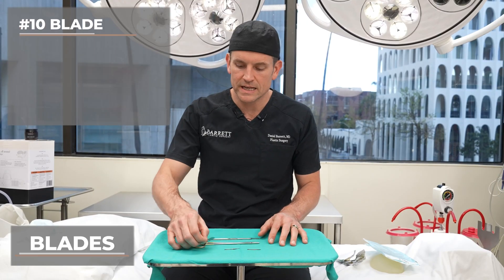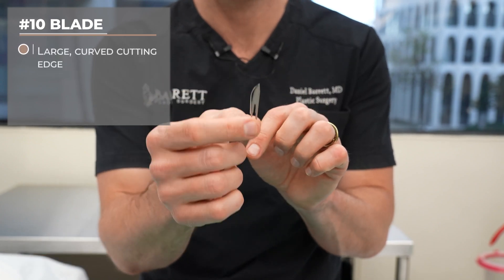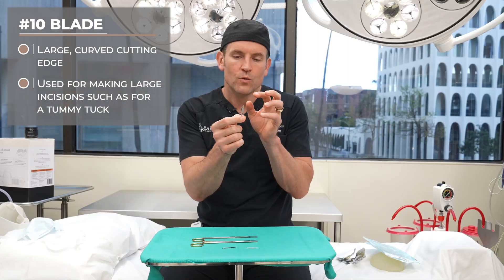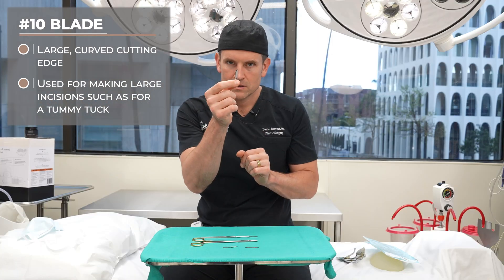Let's talk about the blades first. First is a number 10. The way I like to remember a 10 blade is this is a big fat blade. It's used for making large incisions, oftentimes for general surgery applications or making big tummy tuck incisions. The way to remember a 10 is the zero kind of looks big, fat, and round. That's a 10 blade.